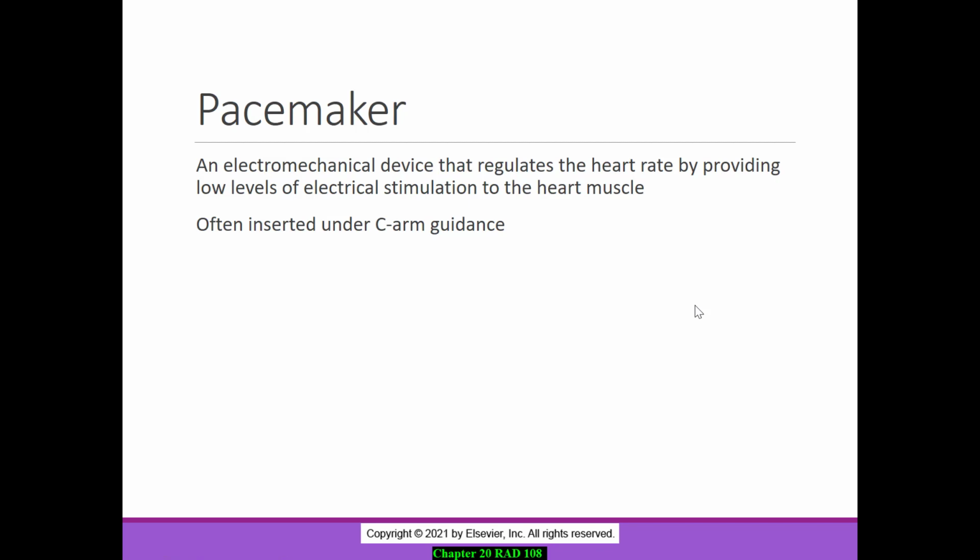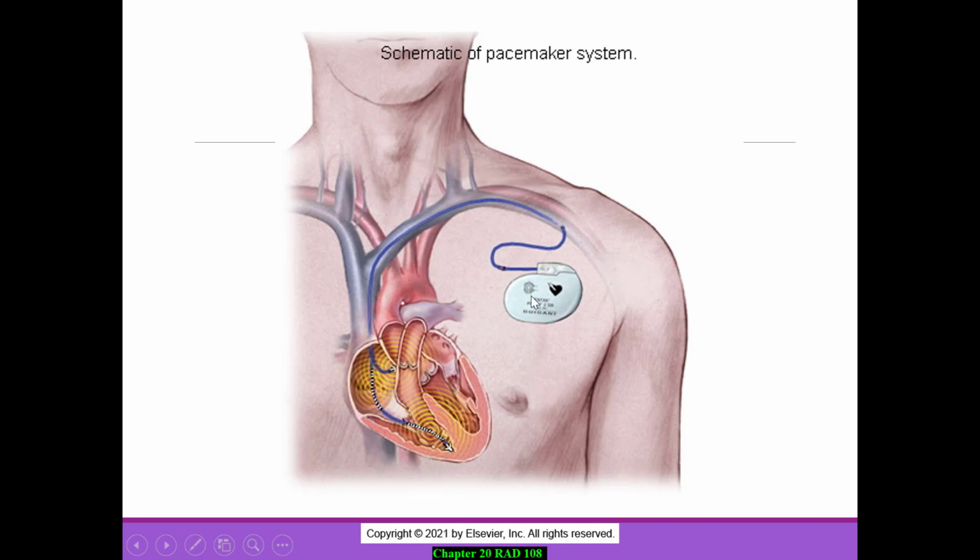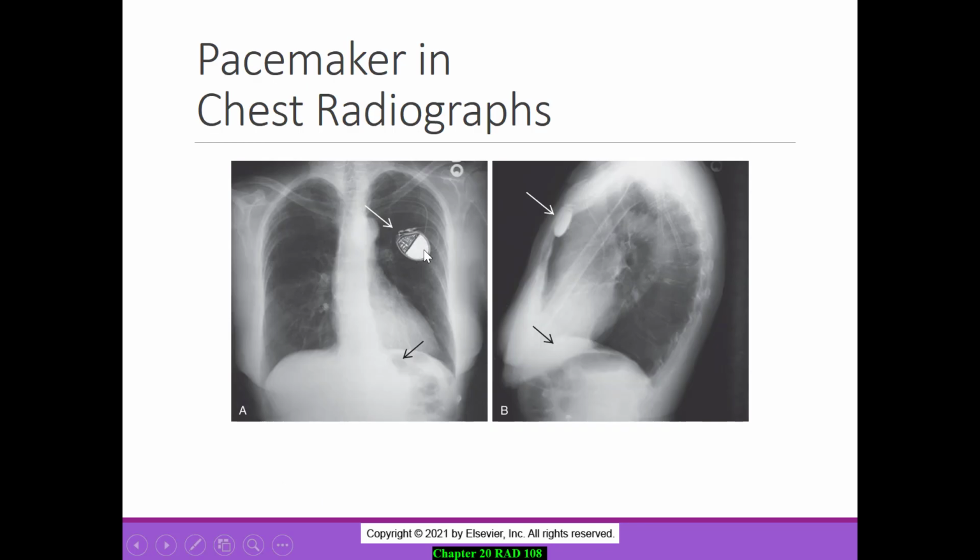Pacemakers are an electromechanical device that's going to regulate heart rate, providing low levels of electrical stimulation. And these are often inserted under C-arm guidance as well. And this is what the device looks like inside your patient. And here's where it goes into the heart. And this is what it's going to look like on your radiographs.